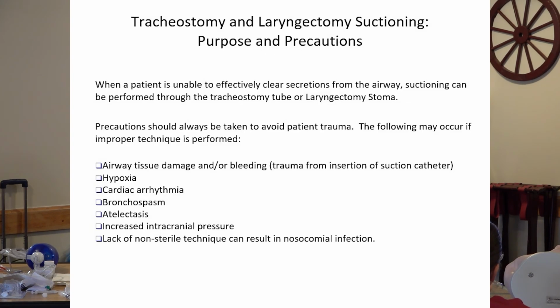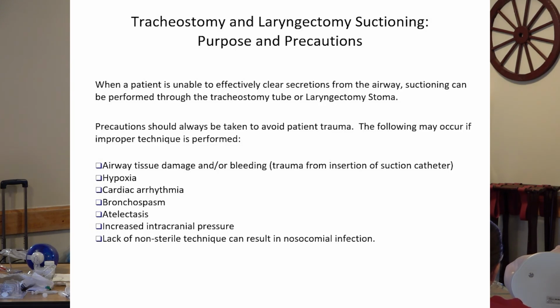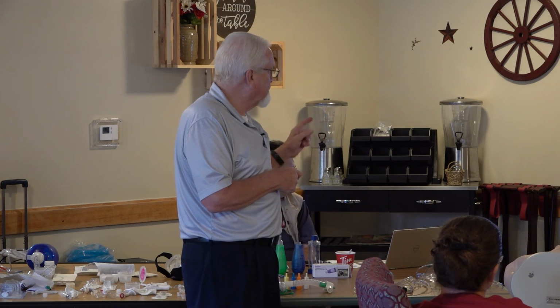Let's see. Again, the 15 seconds. Cardiac arrhythmias because of the stimulation, but you're watching them with the pulse ox anyway, so you keep an eye on that. Bronchospasms, what I was just telling you about, that grab on the catheter. Atelectasis, back to the grapes: if there's no air getting in there to keep them inflated, they're going to look like raisins.